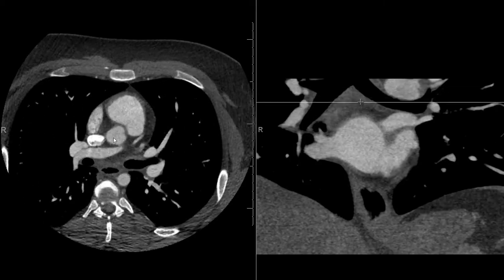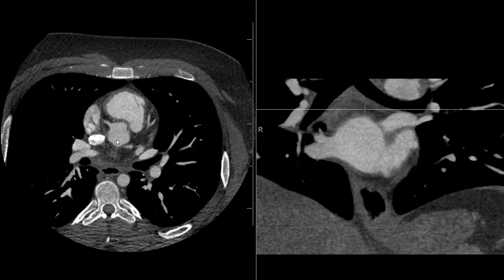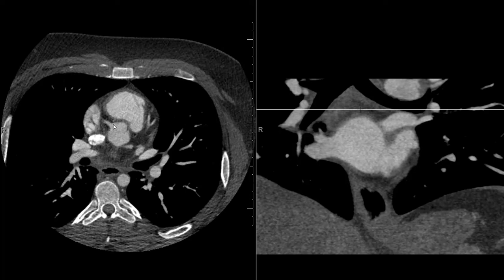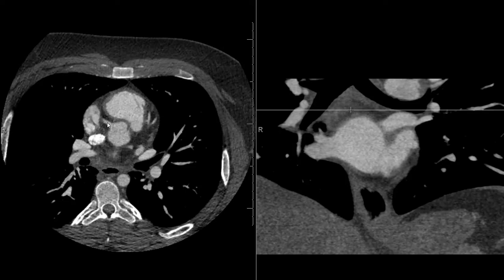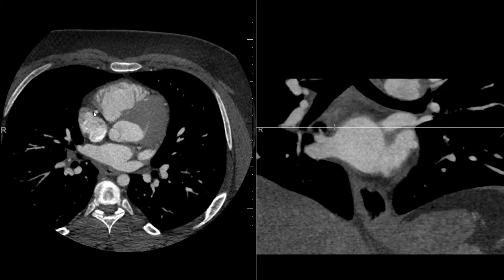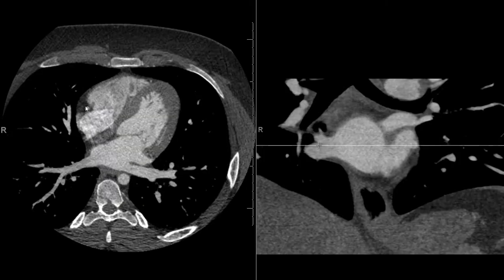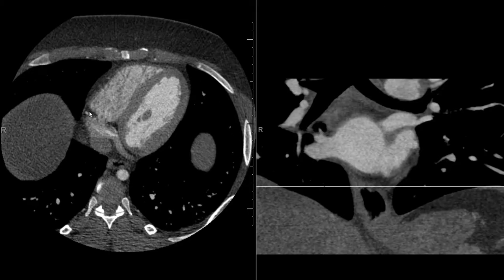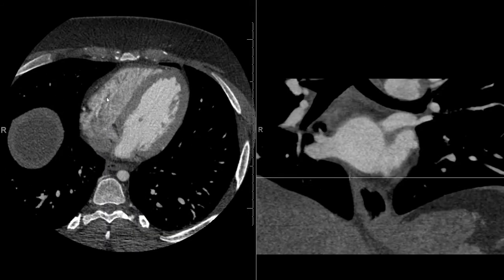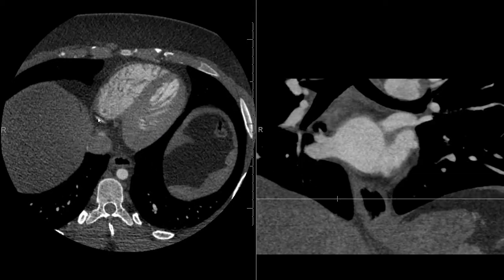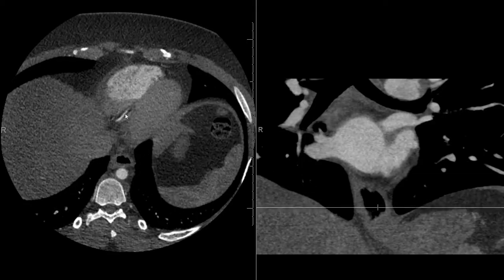But before that, we have the takeoff of the coronary arteries — there are two main takeoffs. From the right coronary cusp, we have the right coronary artery, which takes off coursing anterolaterally and inferiorly. It courses in the right coronary sulcus, also known as the atrioventricular groove or AV groove, here between the right ventricle and right atrium, coursing inferiorly down to the bottom of the heart.